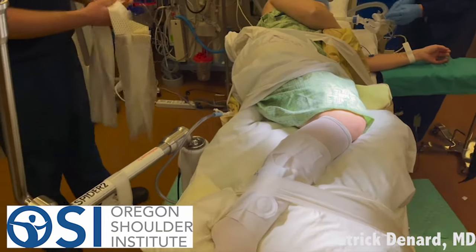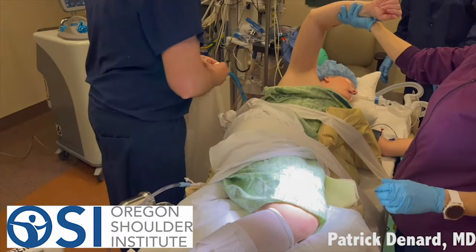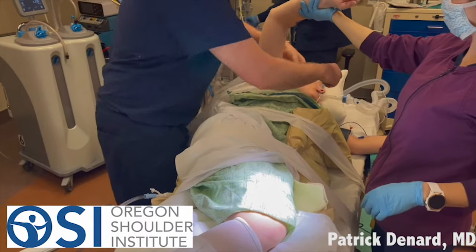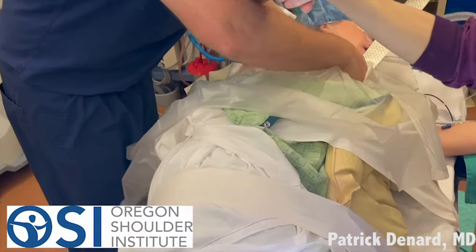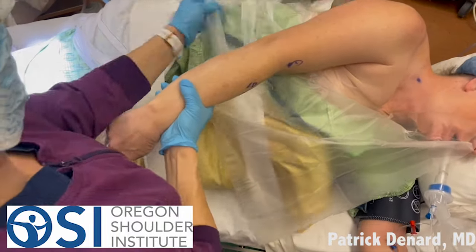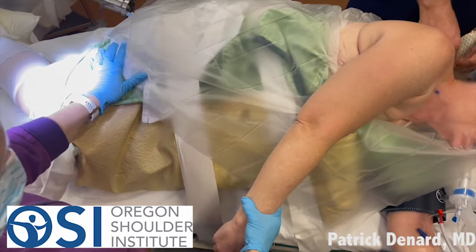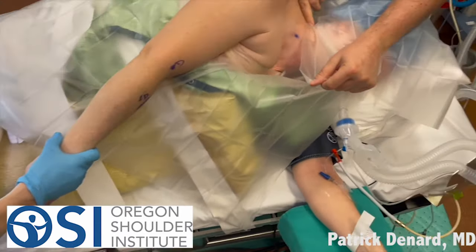We use an articulated arm holder — you see there on the left, that's that metal device. That'll be for positioning of the arm, and then we drape the arm. We use a couple of clear plastic drapes. These isolate the field of the arm. One goes up around the shoulder blade, and another goes across the neck.